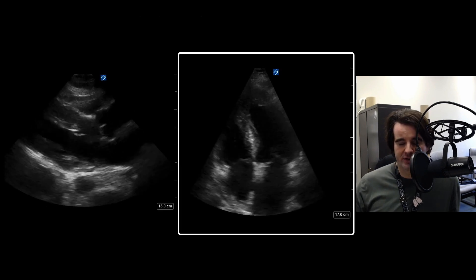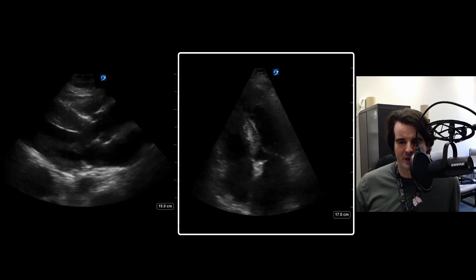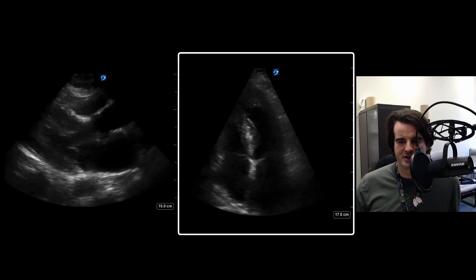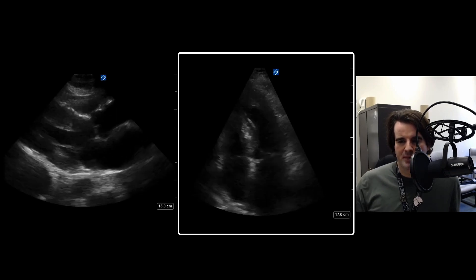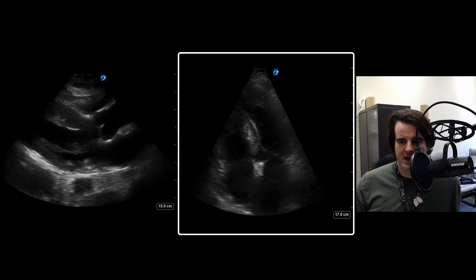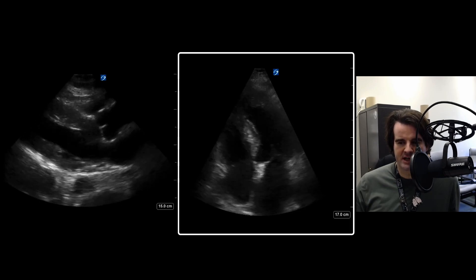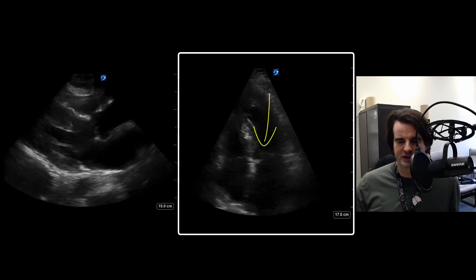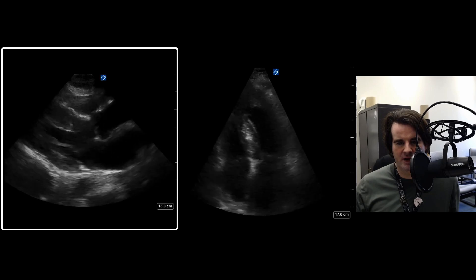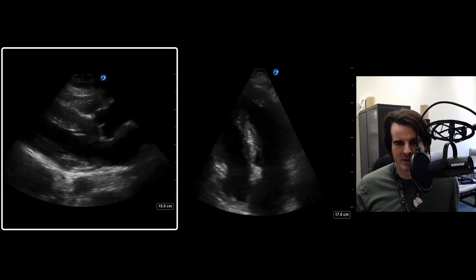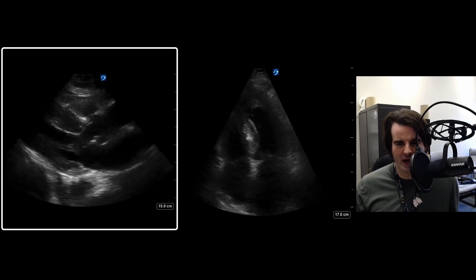In step one, let's talk about identifying the nidus of obstruction. Back to that echo — the apical four-chamber view shows a pretty bulky septum, especially the basal portion, which raises concern that it may be causing some degree of obstruction of the outflow tract. Even more insidious is that the mitral valve structurally is not normal. Rather than the cusps coming together in the midline during systole, they're actually being pulled towards the LVOT. In the parasternal long axis view, we see again this fairly bulky basal and mid septum, with very little area for blood to escape during systole through the outflow tract.